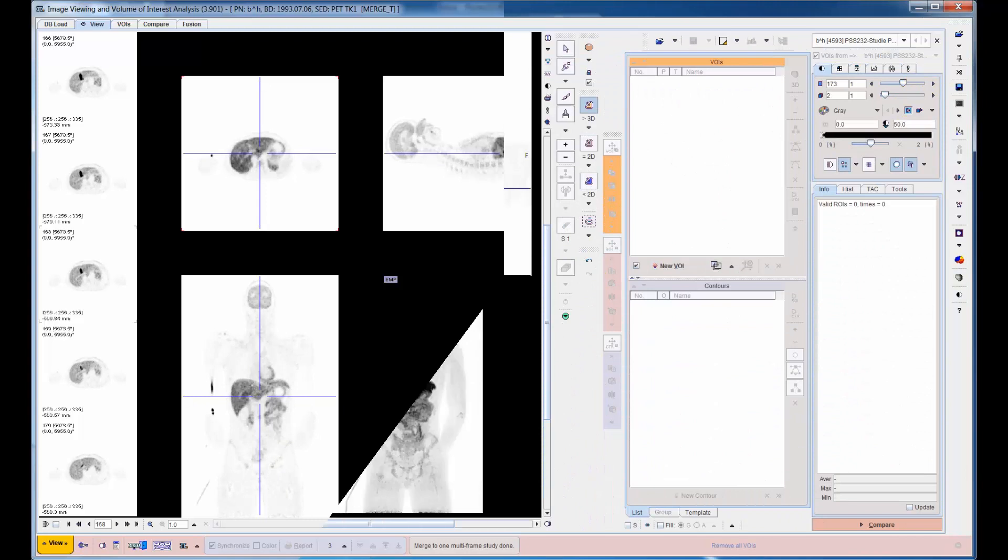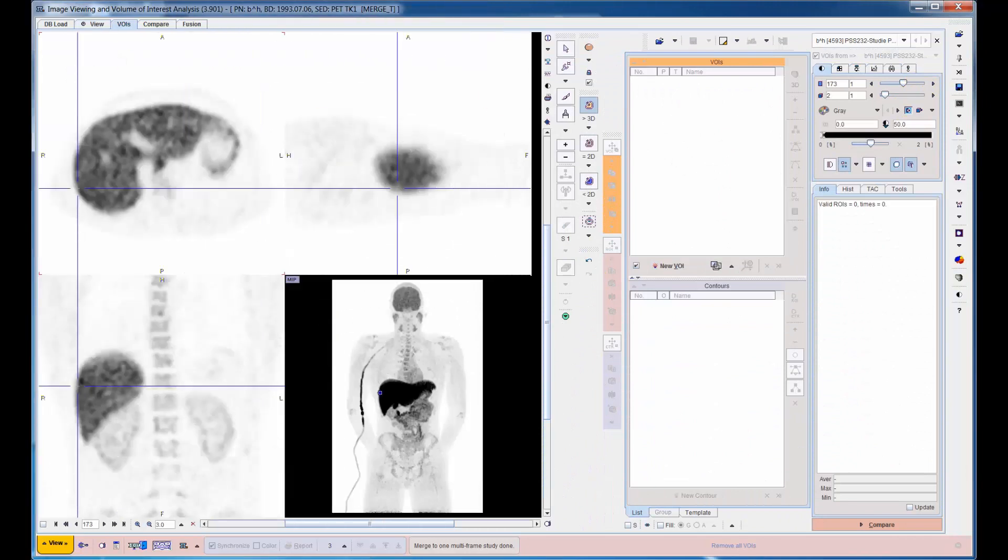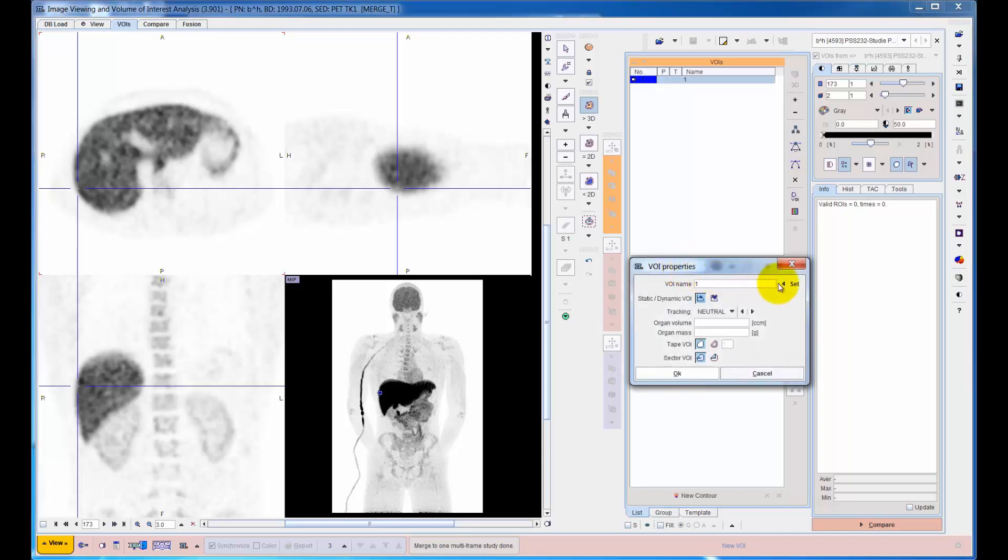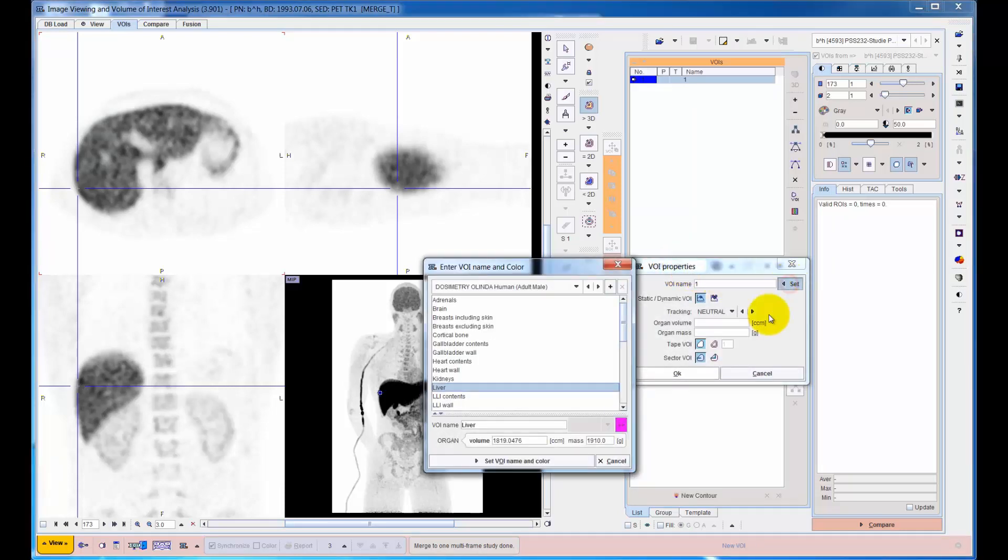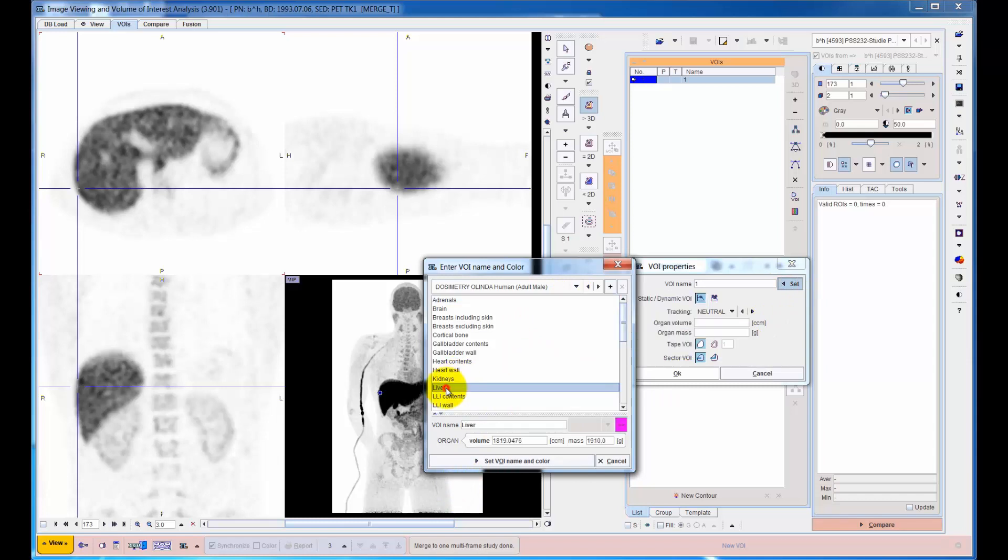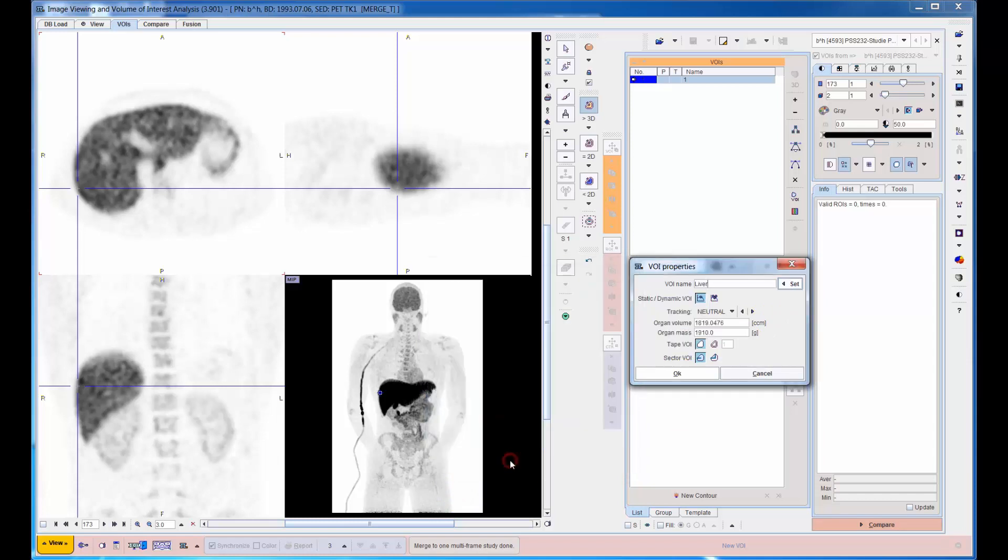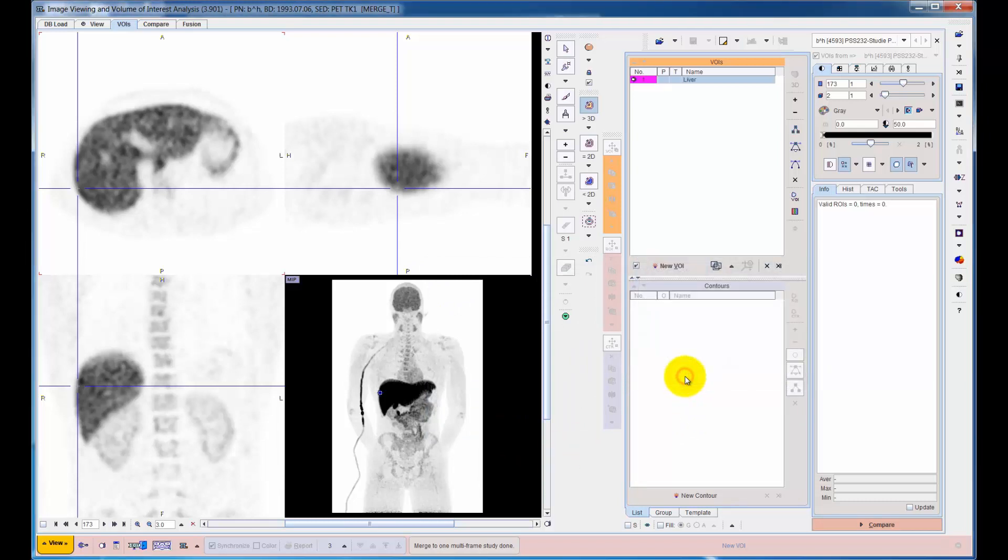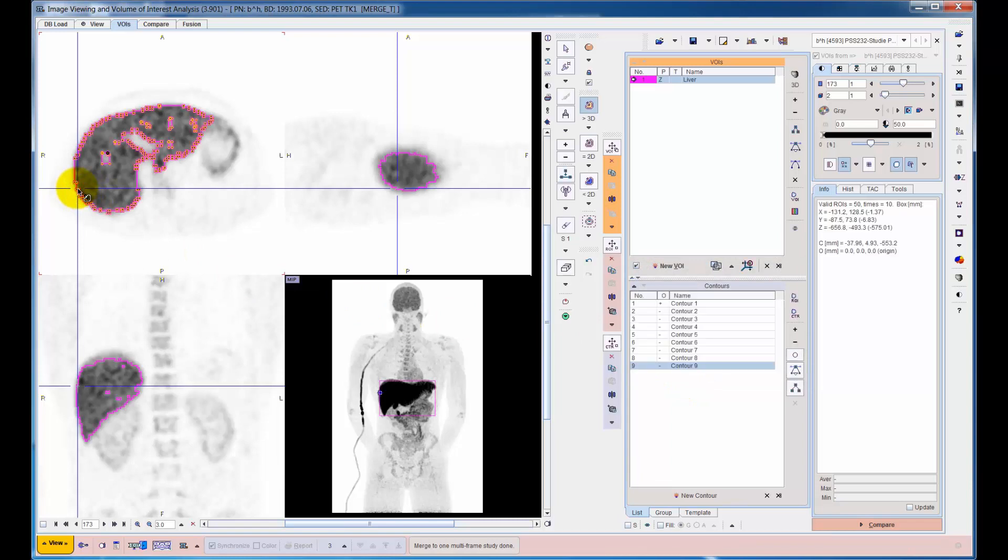On top of this new series, VOIs of the relevant organs are manually defined as follows. For each organ, a definition is selected from the dosimetry list. Then, its boundaries are outlined using an appropriate contouring method. The example shows isocontouring of the liver.